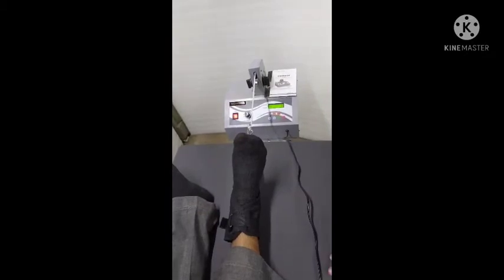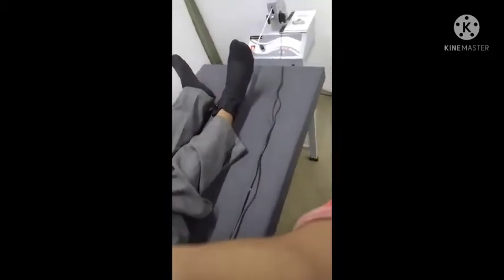Okay, after that we have to unlock the traction table lock. It is here, so we unlock it, and now we start the treatment.